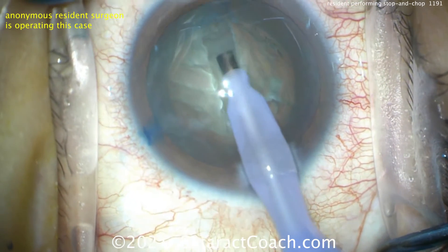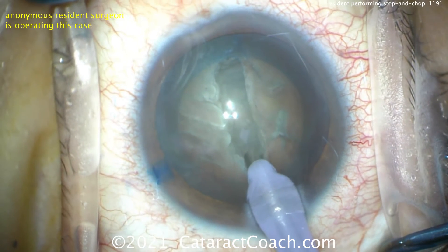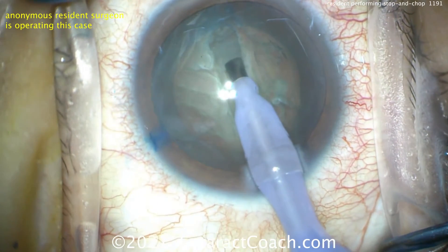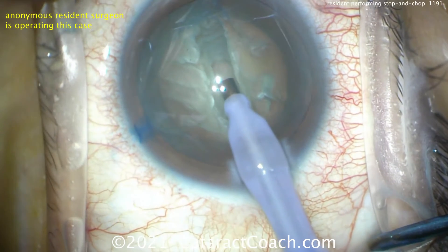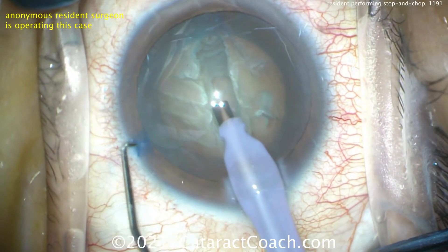Lifting up to avoid going too deep in any one spot. You can judge the depth of the groove when you start to see the red reflex shining through the bottom. You can also judge by comparing it to the phaco tip — how deep is it compared to that tip? That groove looks pretty good now.